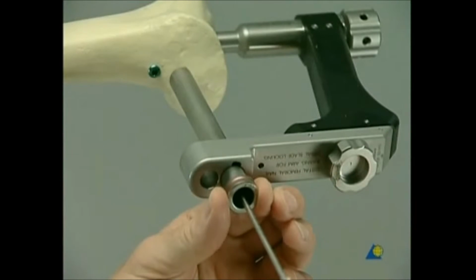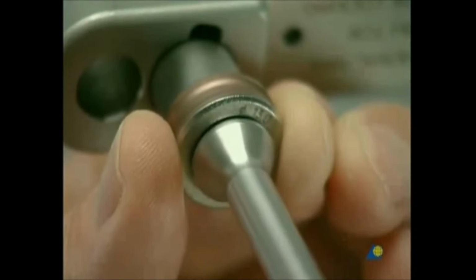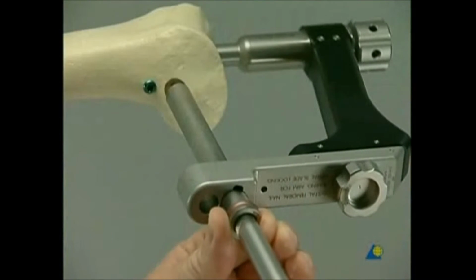The 13 millimeter drill bit is inserted over the guide wire and through the protection sleeve. The seat for the head of the spiral blade is prepared by drilling open the lateral cortex. The automatic stop prevents the drill bit from penetrating too far. The drill bit and the protection sleeve are removed.